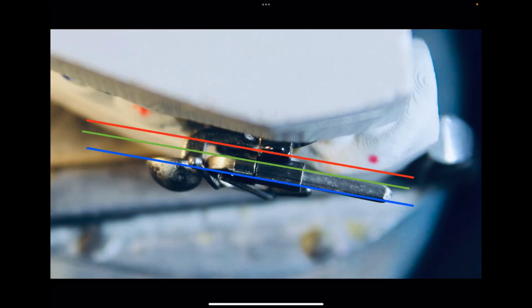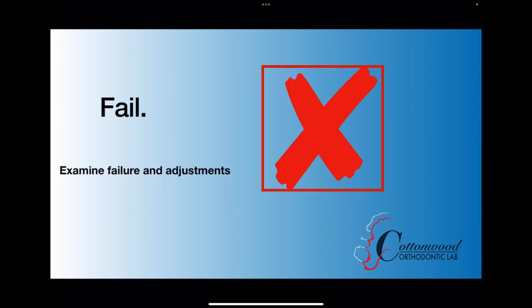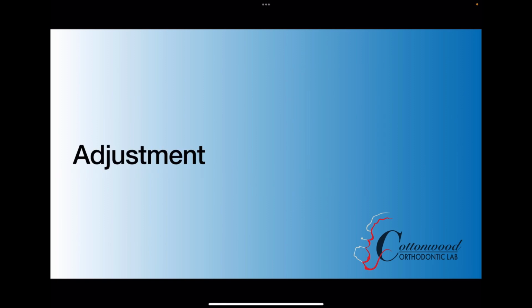So this is another angle, and the lines help us show two different things. The blue and the red line show us that our upper tube and elbow are all in a parallel alignment with the cam. Then the blue and the green indicate that we're about 50-50 split on that cam. So we've passed that. Now what happens if we see some failures? Let's look at what we can do for adjustments.